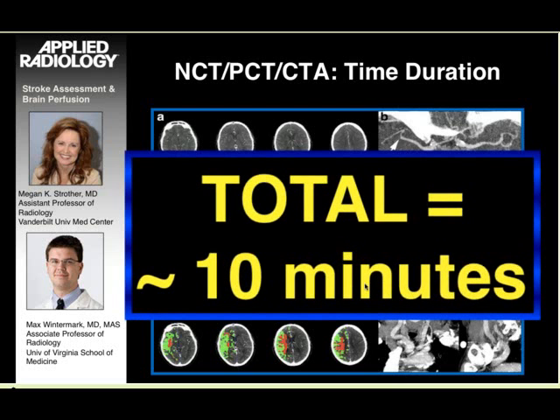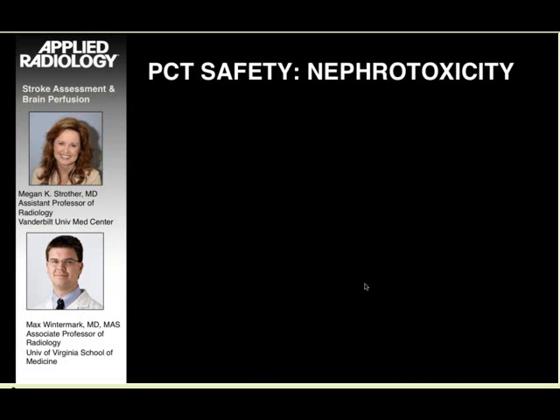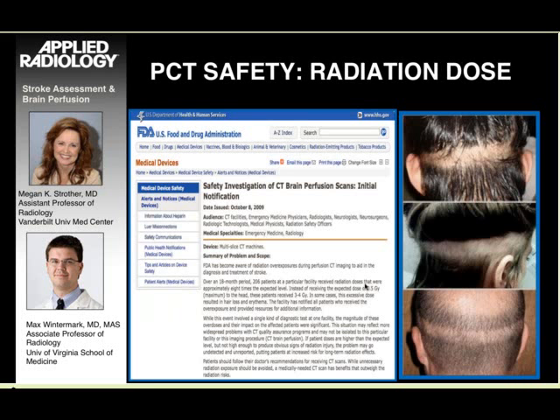And that's something I believe we're going to discuss later in the forum. But in other words, it doesn't delay treatment to obtain those additional images. It just brings you additional information. In terms of safety, you are going to get to administer to the patient some iodinated contrast.